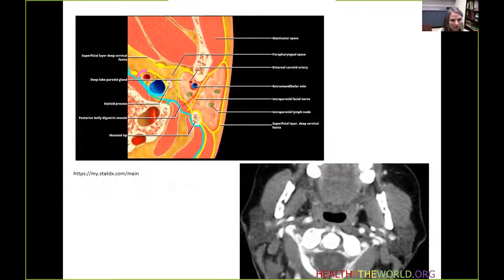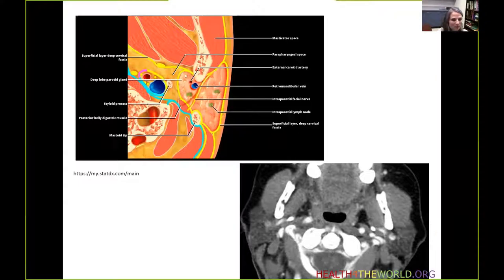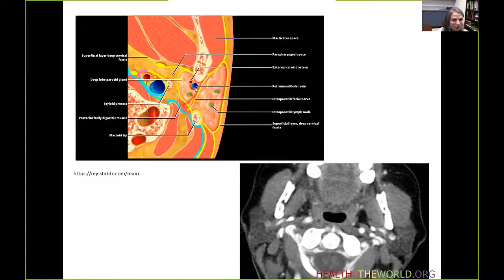Looking at the axial graphic of the parotid space, we can see that the superficial layer of the deep cervical fascia encapsulates the parotid space. The parotid gland is completely encircled within this fascia. We can see scattered lymph nodes, the retromandibular vein, branches of the external carotid artery, and just lateral to the retromandibular vein is the expected course of the extracranial facial nerve.